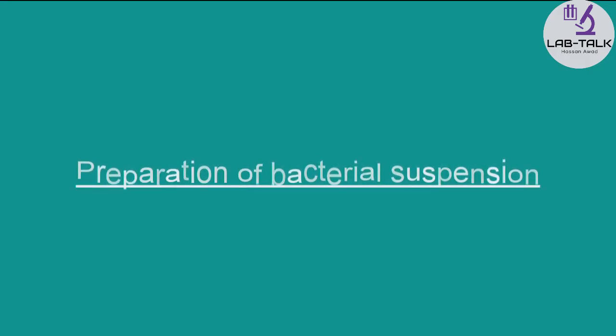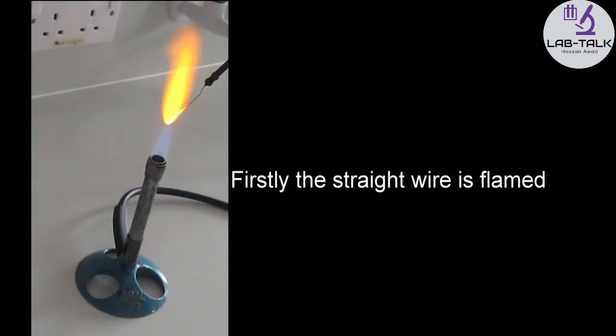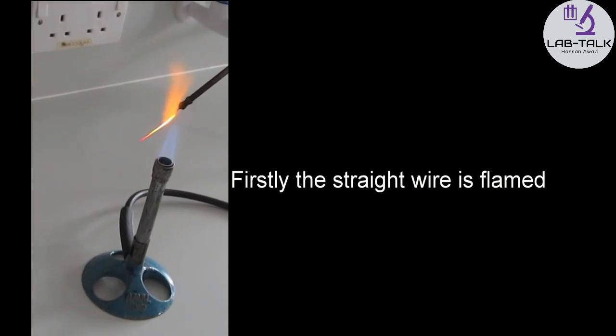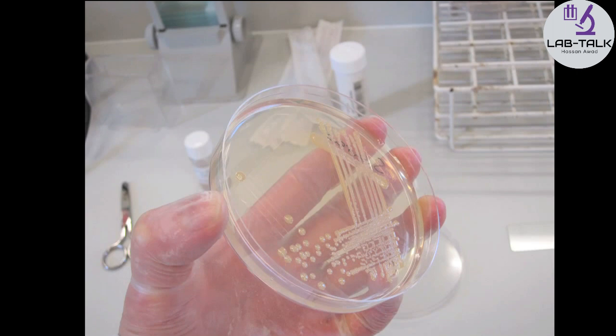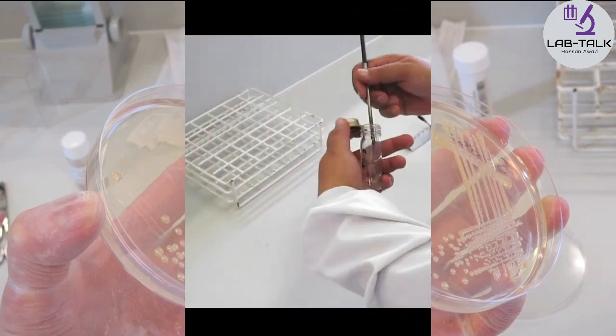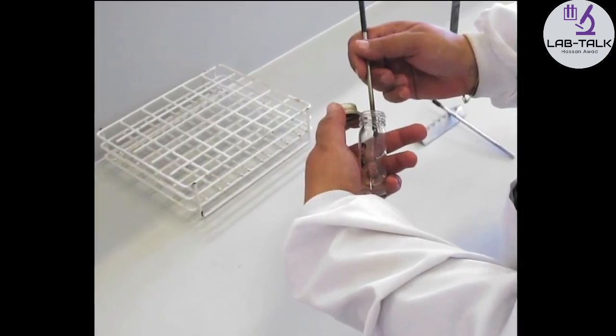Preparation of bacterial suspension. Approximately three to four colonies of the unknown bacteria are taken from the agar culture. The colonies are transferred into 5 ml of saline solution. A cloudy suspension should be obtained.